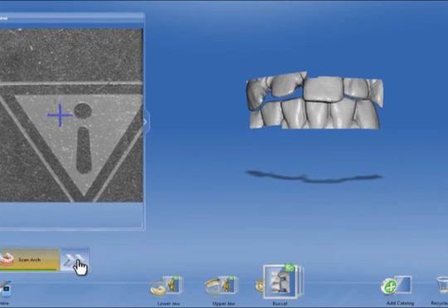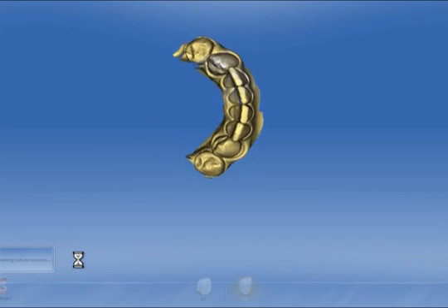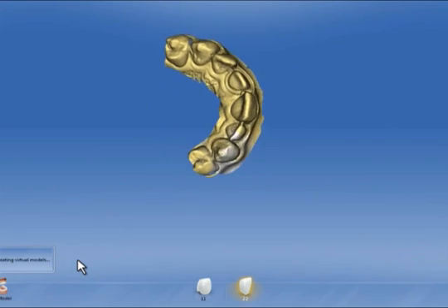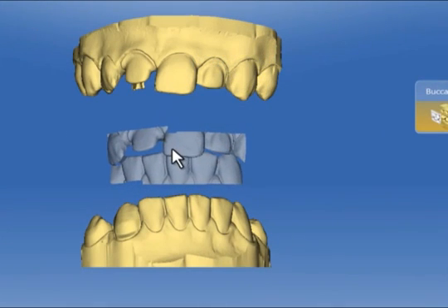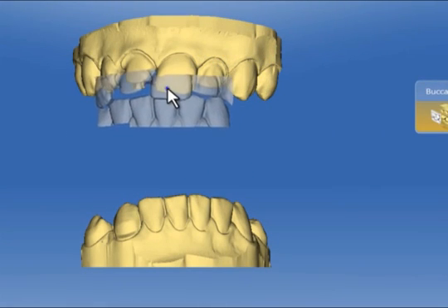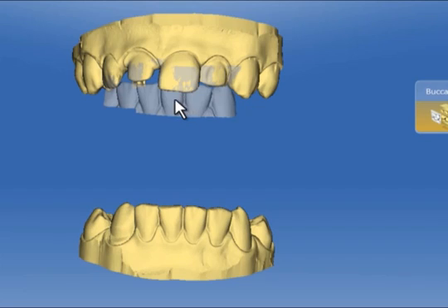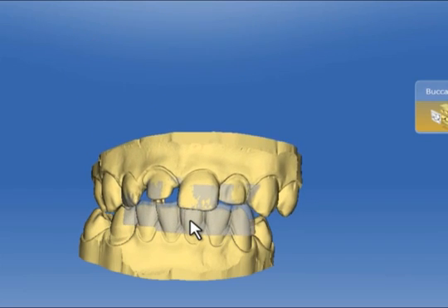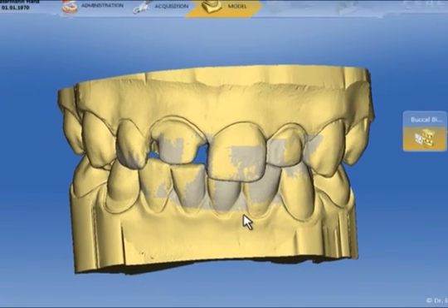The software now begins to calculate the model. Once this computation is completed, the model is displayed and the bite situation can be registered. We take the buccal exposure and drag it up until it matches the upper jaw model. Turn the lower model into position and drag the buccal bite down to match the lower jaw. Now we have a complete model.